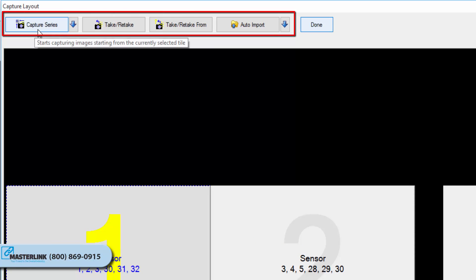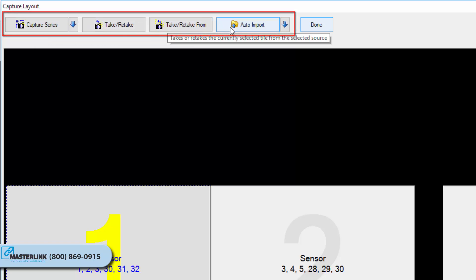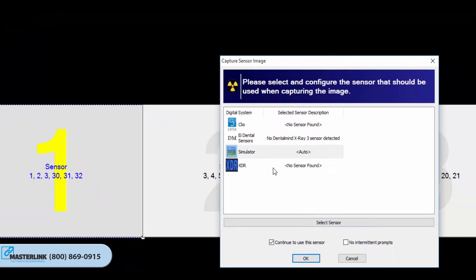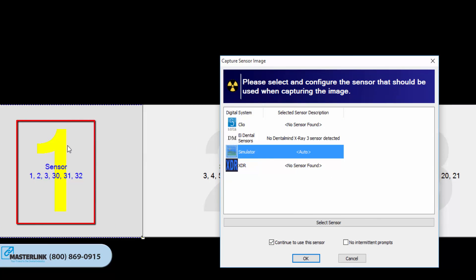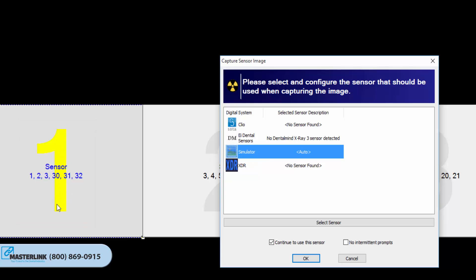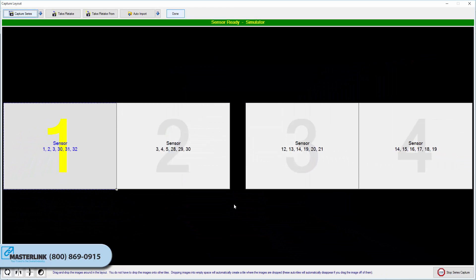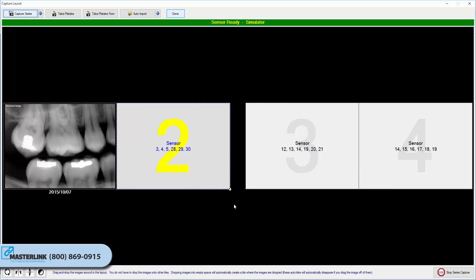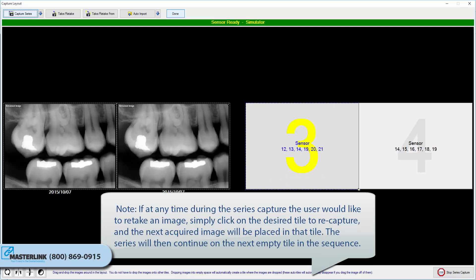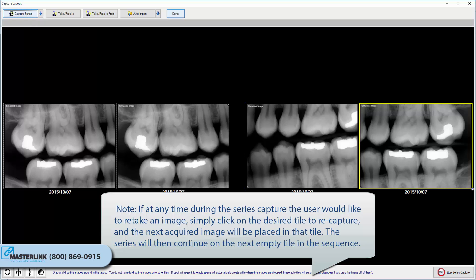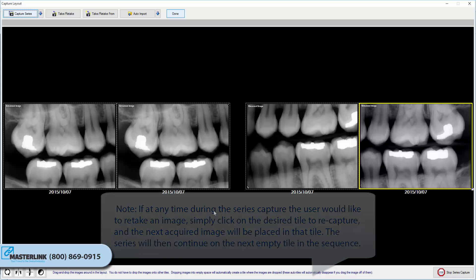These are your capture buttons, used for image acquisition. The Capture Series button begins the automated series capture. The large yellow numbers on the layout tiles indicate the order in which they will be captured. If no preferred imaging extension is set for the layout, the user will be prompted to select an available imaging device. If at any time during the series capture the user would like to retake an image, simply click on the desired tile to recapture, and the next acquired image will be placed in that tile. The series will then continue on the next empty tile in the sequence.